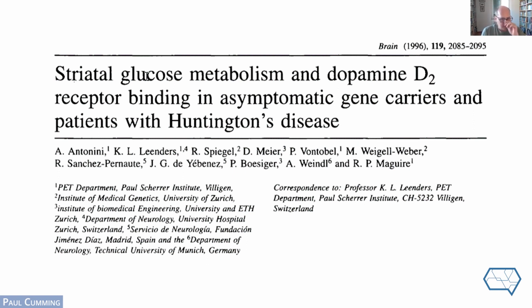Now, people in Switzerland, where I happen to sit right now, were early investigators of not just the FDG PET, which, as you saw, was already documented in the 1980s, but they also applied dopamine PET using a different tracer, a dopamine marker, in the same subjects, in different sessions: on one day FDG PET and another day PET for dopamine receptors, to look at the relationship between the metabolic disturbance and a specific neurochemical marker for the integrity of the dopamine system in the brain.